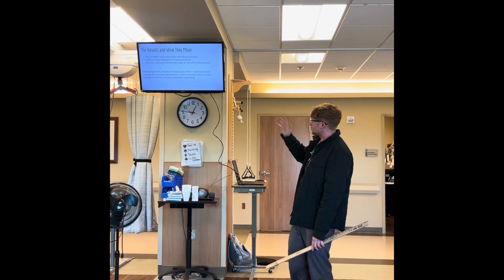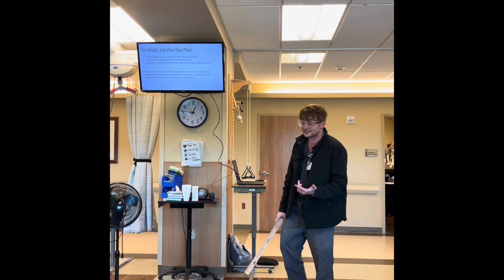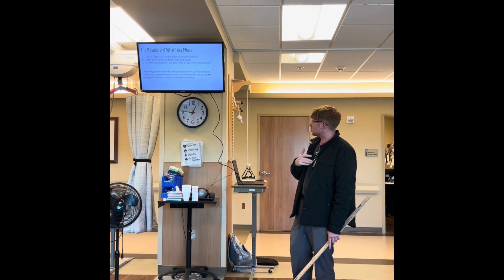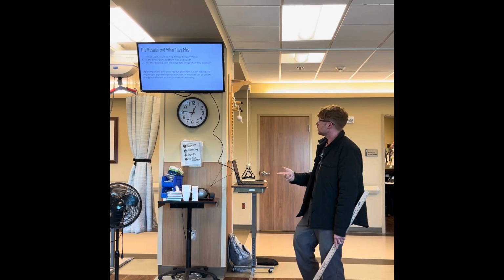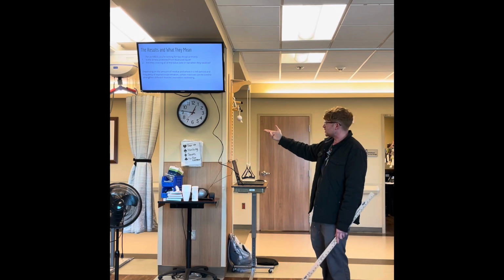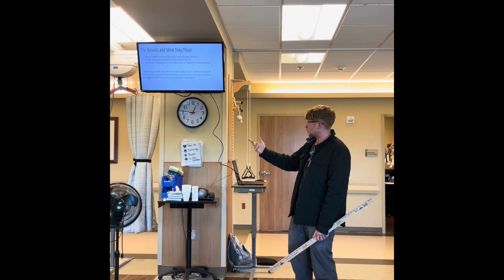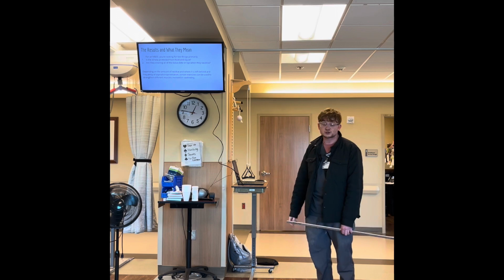With an MBSS, in the results we're looking for primarily two things. Is the airway protected? Do we have aspiration or penetration, which we'll get to? And then are they clearing all of their bolus, which I've got there as a bite or a sip. We call that the bolus. When they swallow, is there a lot left behind? So depending on the amount of residue, where it's left behind, and how often aspiration or penetration, or the amount of that, there are certain exercises we can recommend to strengthen the different muscles involved in swallowing.